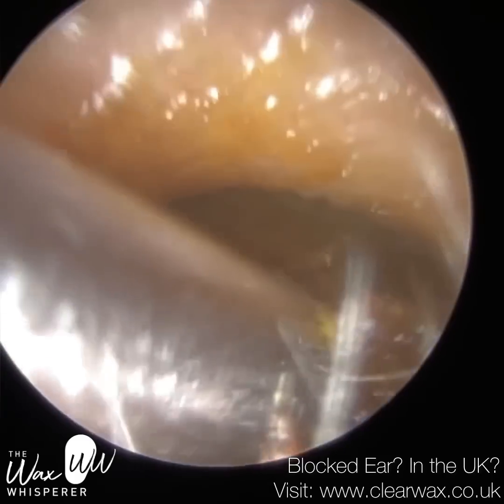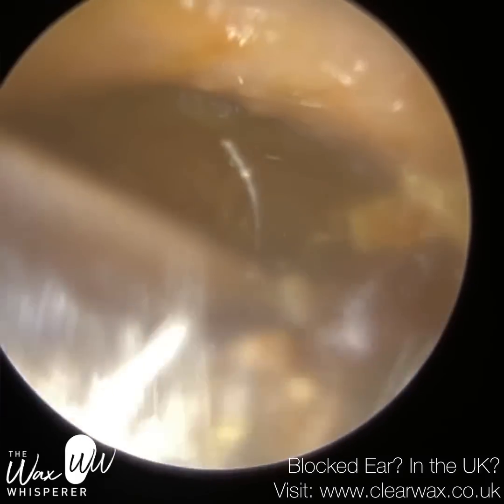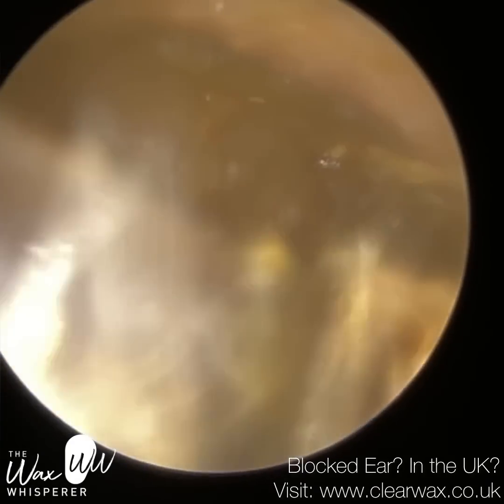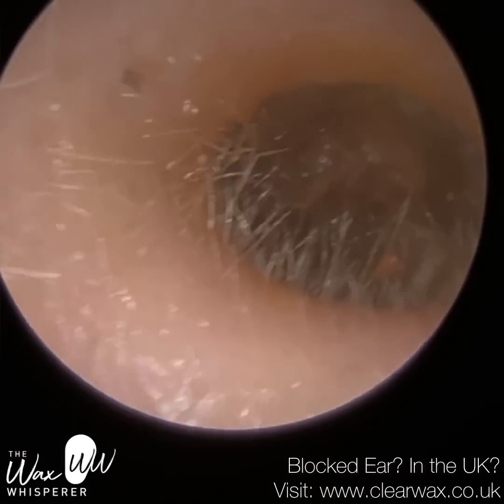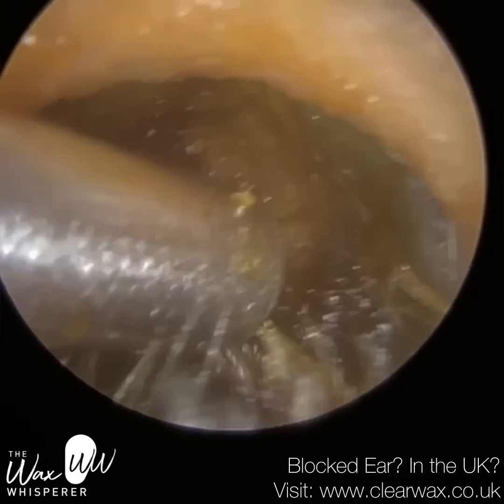This is their right ear, similar tale, very sticky wax, so I'm going to put some oil in, I assume I am, we'll just see. This is right near the entrance, guys, hence why the endoscope is right close to it, because the endoscope needs to be in the ear because it's an endoscope, the clue's in the name, in order to visualise the wax.